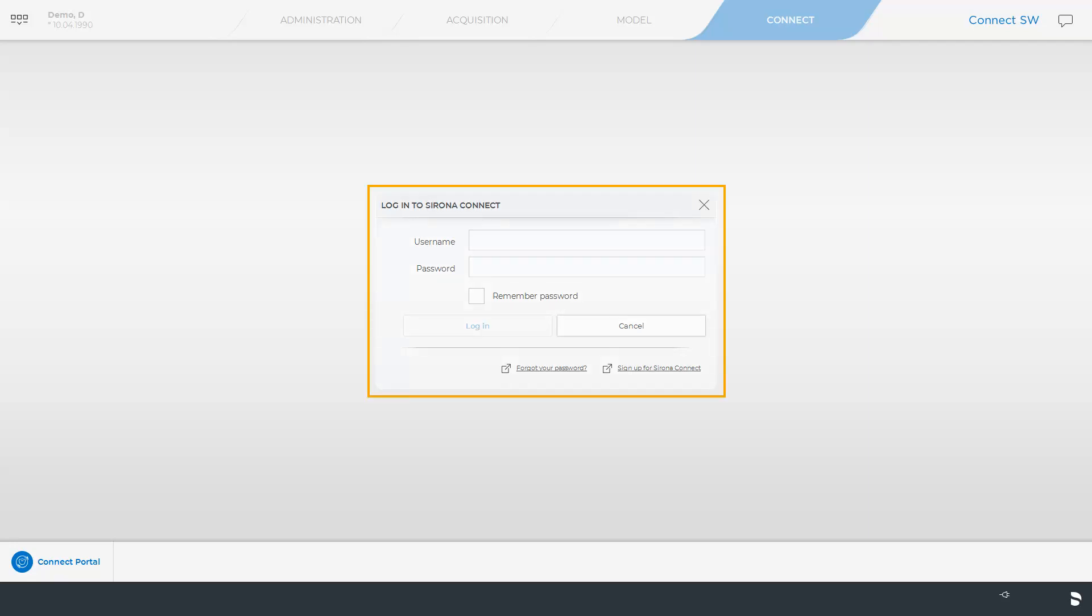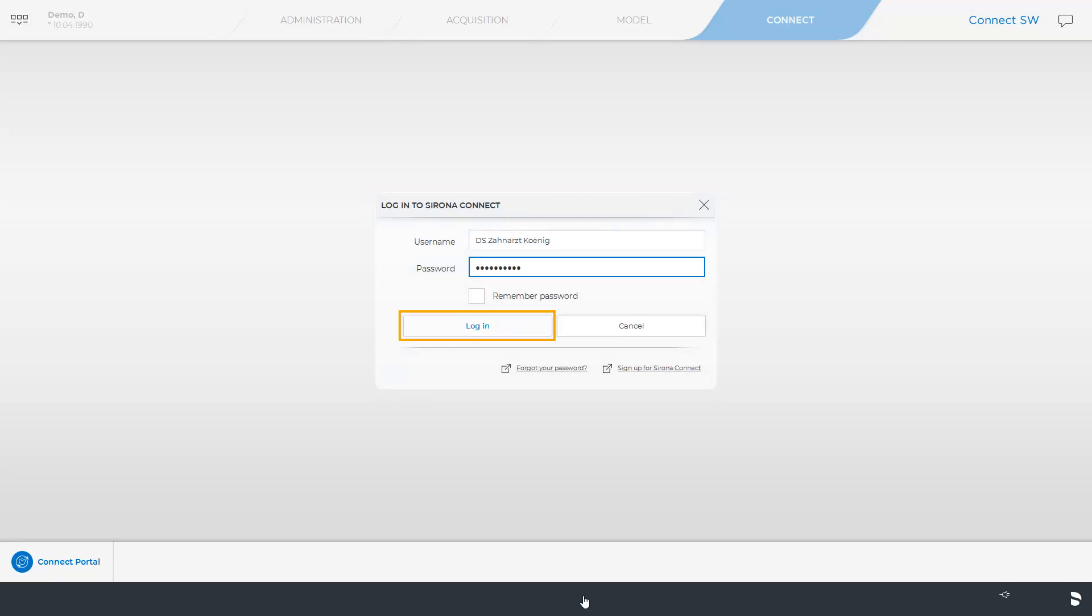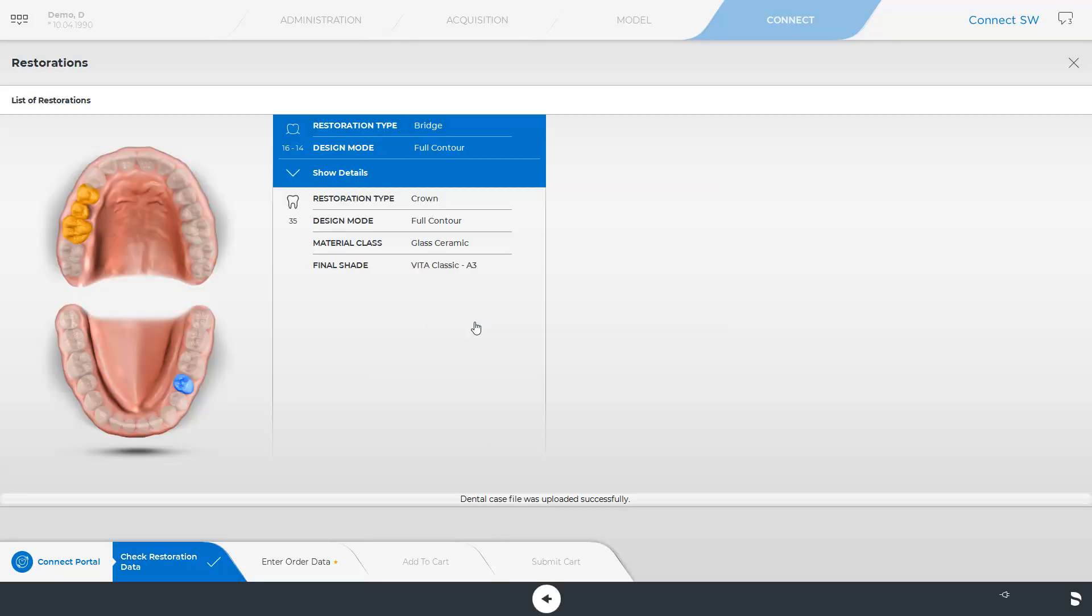Here, we will enter our username and password and click on Login. As soon as the connection works, we can check our restoration data again and switch to the next obligatory step, Enter order data.